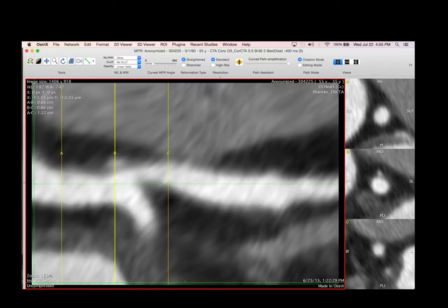As the scanner technology has progressed, you now, as a radiologist, could look at this picture and ask, is this stenosis clinically significant? I pulled this slide from Elliot's talk. You can cut these images here with the yellow line, and now you can look at it and say, what is the area change, for example, in that vessel, and try to characterize how significant that lesion is.